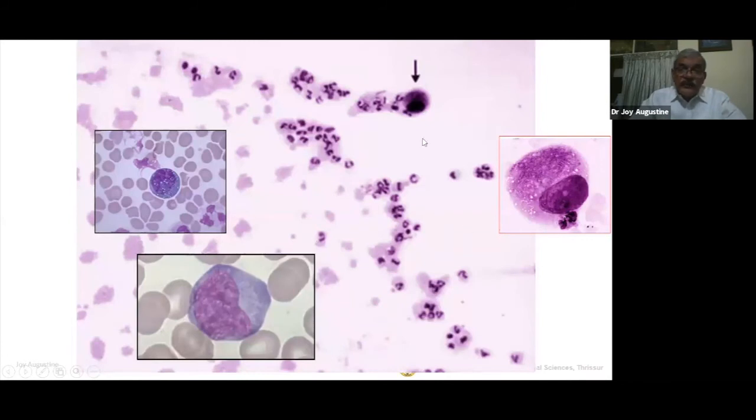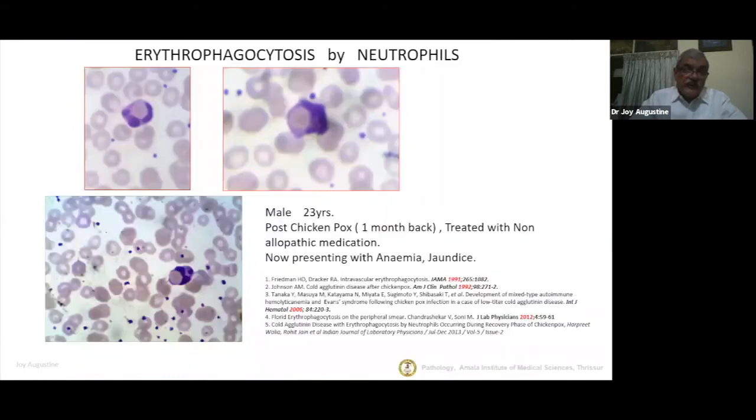Now, CMV infections, you can get intracytoplasmic inclusions inside, and that can be seen. And you also find atypical lymphocytes in plenty, so much so that CMV is also known as transfusion mononucleosis, or whatever you want to call it. It produces the same reactive lymphocytes as mononucleosis.